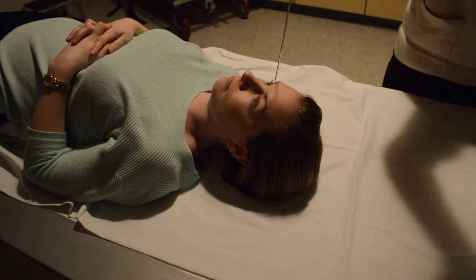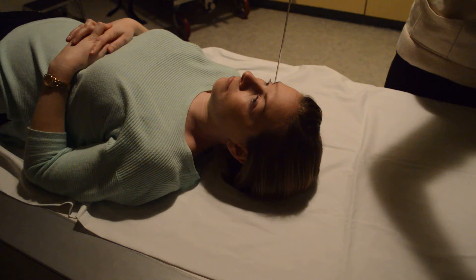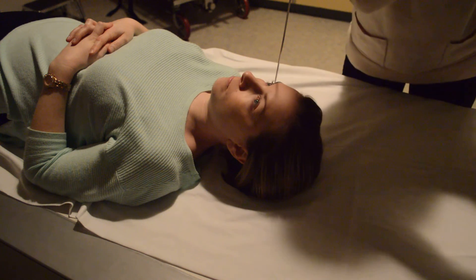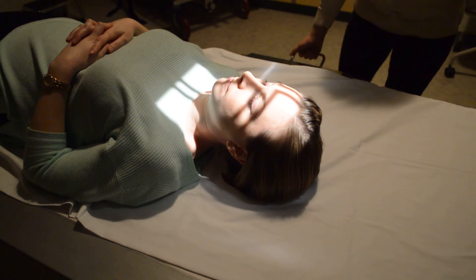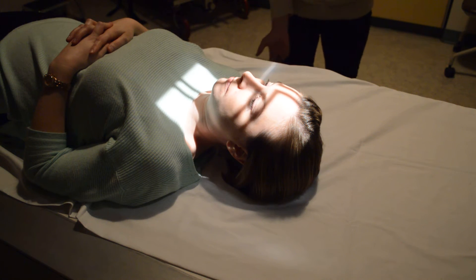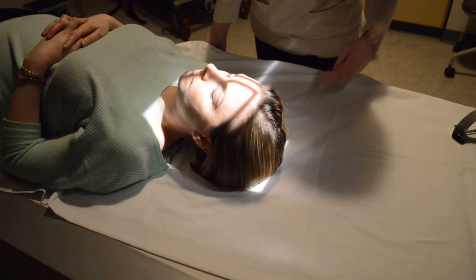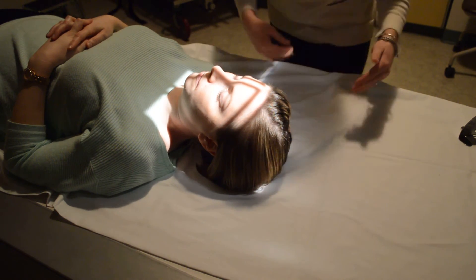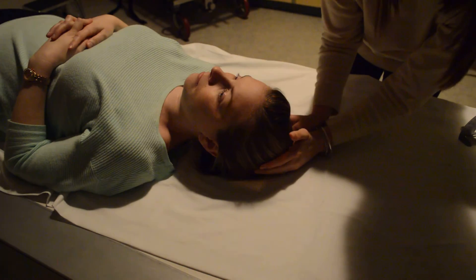I'll go ahead and put a 40 degree caudal tube tilt on my tube — yes, that's going to look like a lot. There is a 45 degree line that you'll have to utilize to line up your bucky. Make sure you pull your cassette out so you can see the line on your bucky. You're going to enter still two and a half inches above the glabella, just like you do for the regular Towne's. I'm collimated to about 8 by 12; you can collimate down to the outer margins.